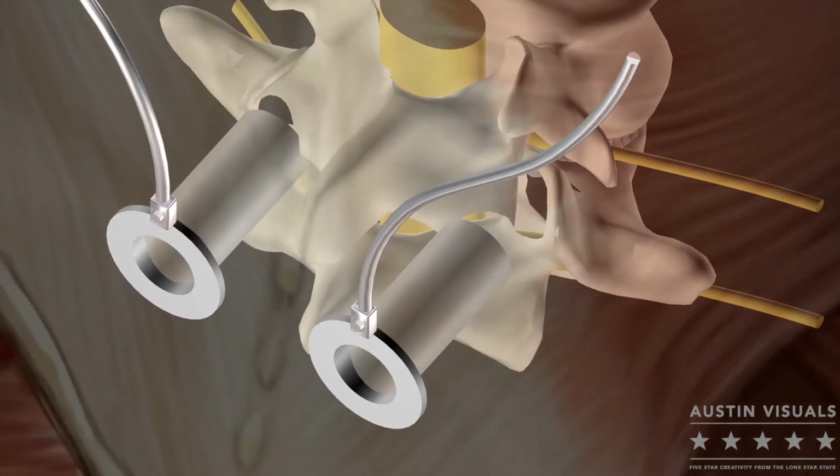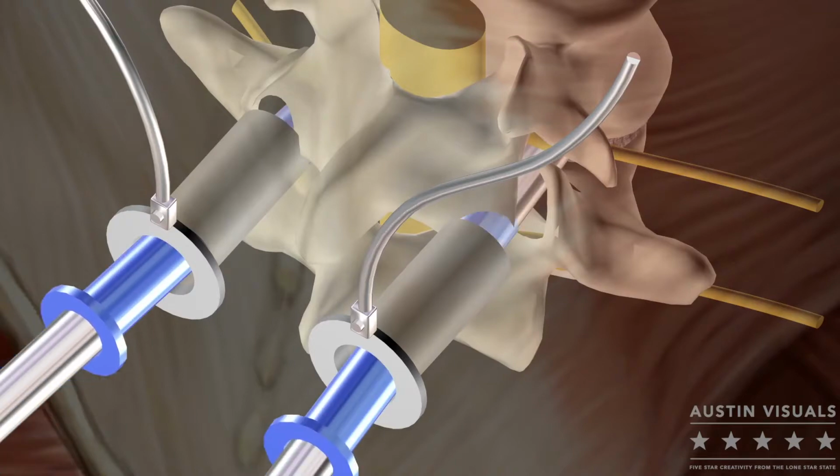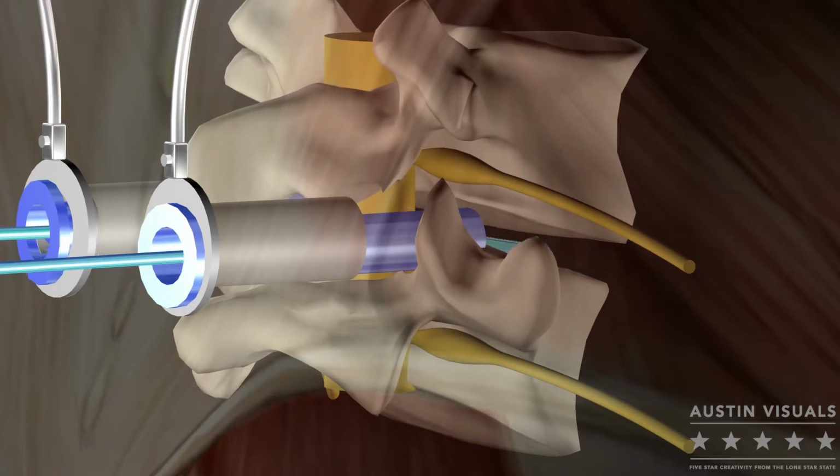Once in the foramen, sequential disc dilators are docked onto the posterior disc, and the disc dilators are angled a few degrees inwards. Ultrasonic disc removal and manual disc and cartilaginous endplate removal of the lateral disc is achieved. Expansion and sizing of the disc space is obtained.